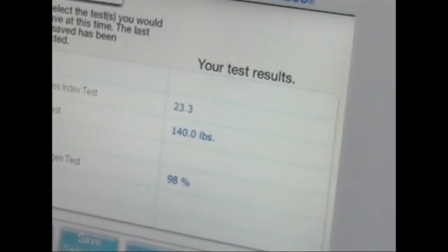When you take multiple tests, and I sort of wanted to show this to you, it'll bring up a menu, and you can choose to save specific tests, or in this case, I'm just going to save them all. So if I hit save all, it'll automatically save these.